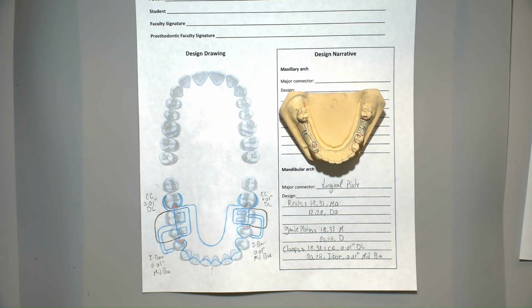The same design concepts and drawings can be used for a final lab authorization used after a final impression for a framework.